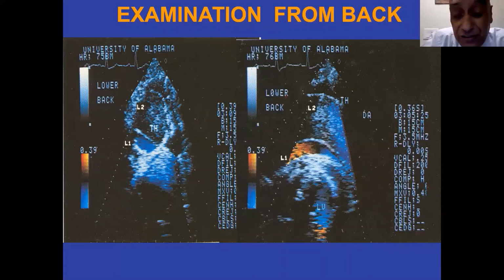The other way to look at the right ventricle is the position of the tricuspid valve versus the anterior mitral leaflet. Normally the septal leaflet of the tricuspid valve is slightly more apical in position by 1 to 2 millimeters. But if it becomes 1 centimeter to 1.2 centimeters, usually 0.8 centimeter per meter squared, then we call it Epstein's anomaly. Otherwise, normally you get what is called offsetting. That is, the septal leaflet of the tricuspid valve is somewhat in an apical position.